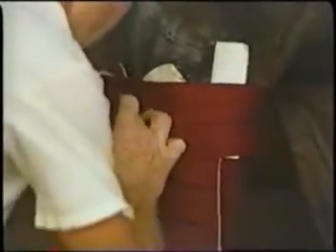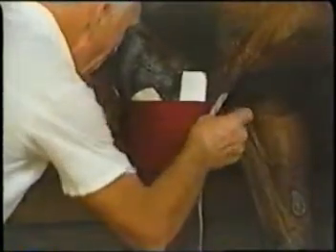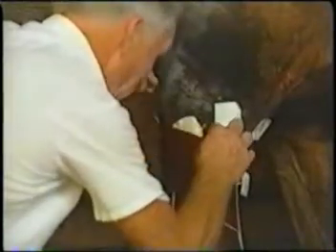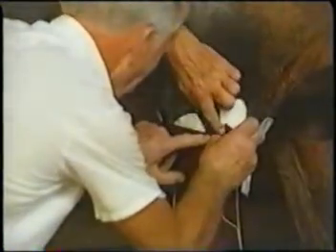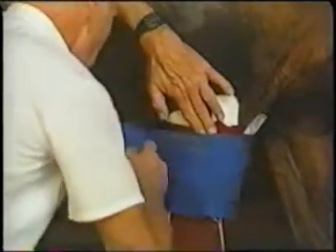Now 2 more pads are put on the back muscles. The electrical stimulator has a total of 4 pads. There are 2 pairs which function separately. The ones on the left switch on first and stimulate the muscles in front, on the front part of the leg, and then they switch off to give these muscles a rest. And the current is switched to the muscles on the back of the leg.